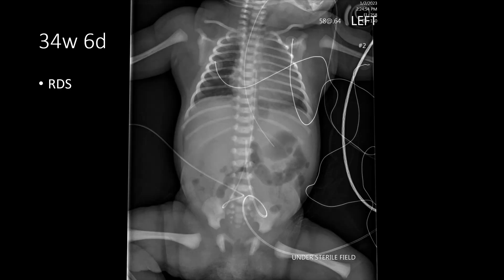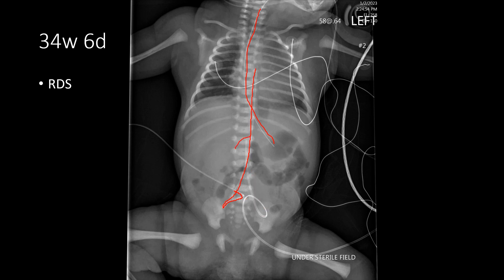In this case we have a premature infant who was 34 weeks six days whose course has been complicated by respiratory distress syndrome. We have a number of catheters in place including a gastric catheter, an umbilical arterial catheter in an appropriate position, and an umbilical venous catheter that is terminating along the inferior margin of the liver. That umbilical venous catheter is low and hasn't been functioning appropriately, so the team needs to establish better central venous access.